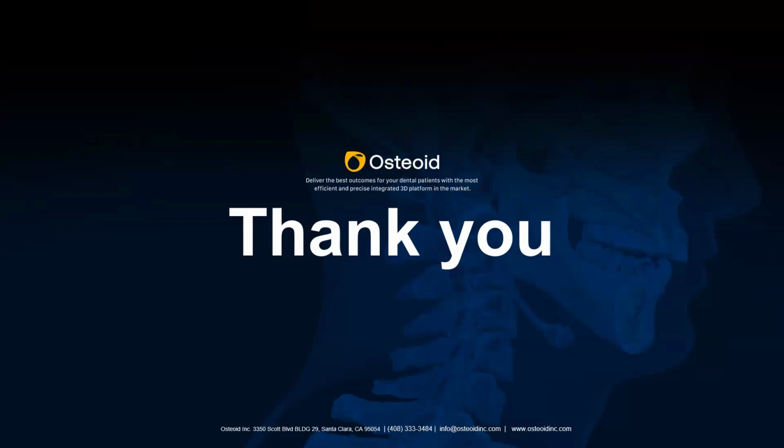Another participant asks, are you worried about dose when taking scans? We abide at the University of Louisville by the AAE recommendations, and within the AAE, there are certainly recommendations about when to take a scan. If there's concerns about anatomy, if there's concerns about fracture, if there's concerns that the regular 2D imaging can't answer. I have changed my position over the last 10 years, and I'm an advocate for the use of cone beam CT on any clinical situation which just doesn't add up.